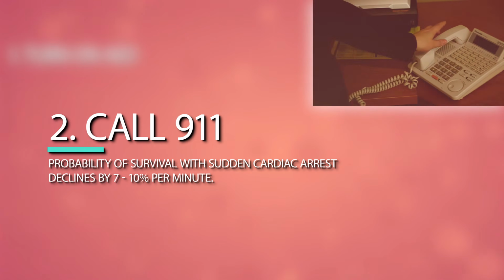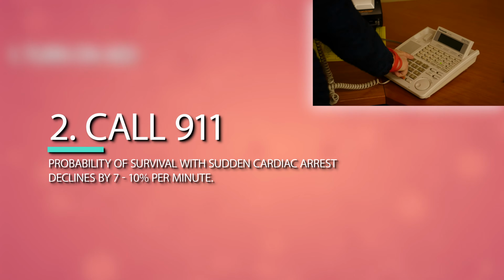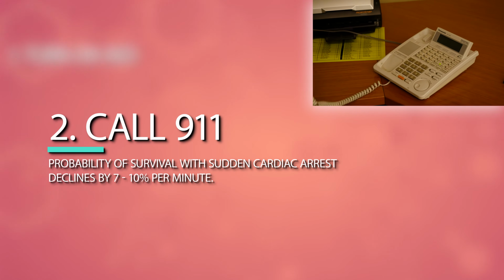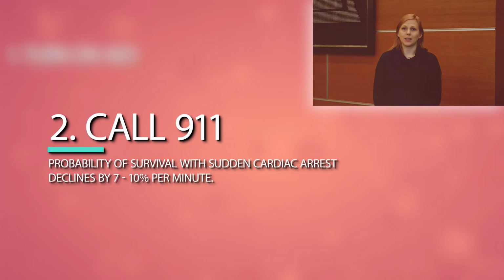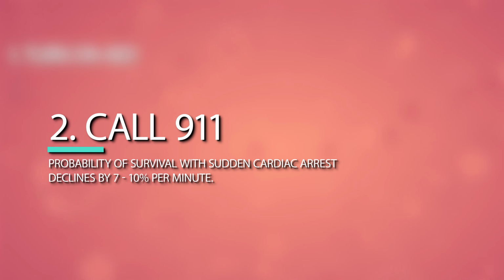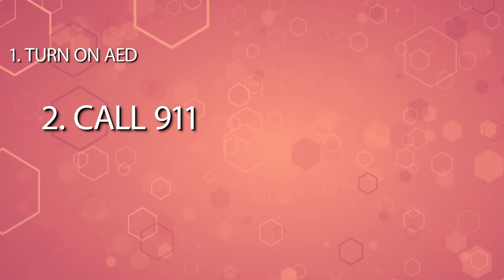Step number 2. Call 911. While it is good that professional help is on the way, time is of the essence. The probability of survival with sudden cardiac arrest declines by 7 to 10% with each passing minute. So let's get going and set up the AED.